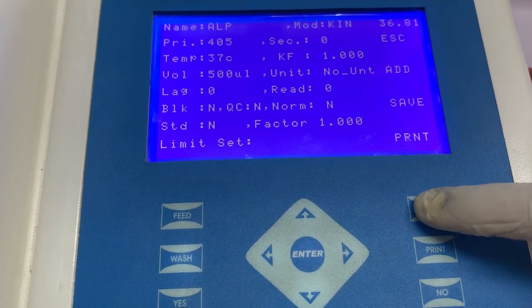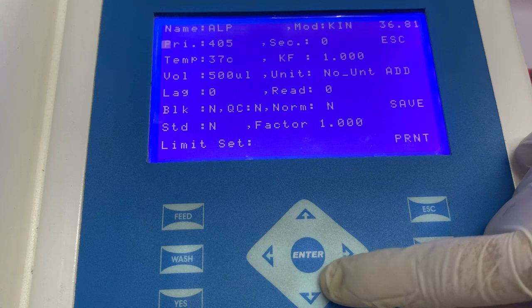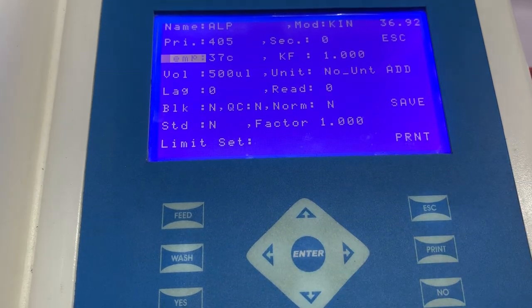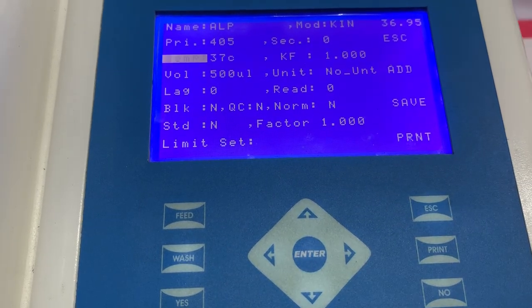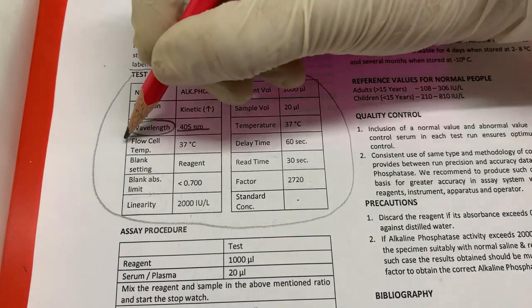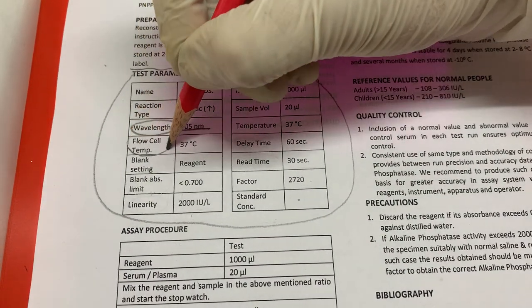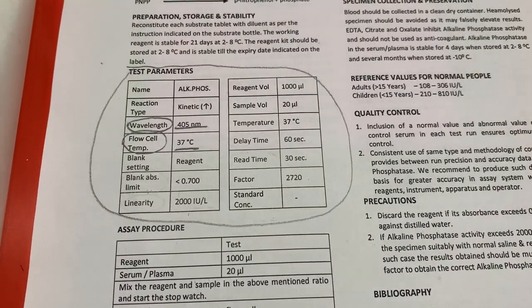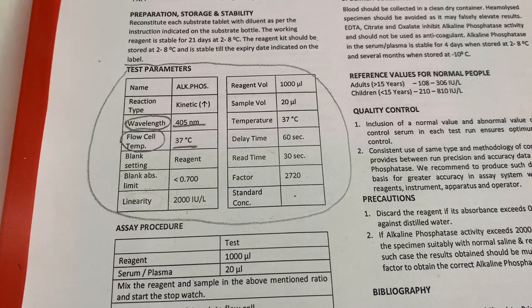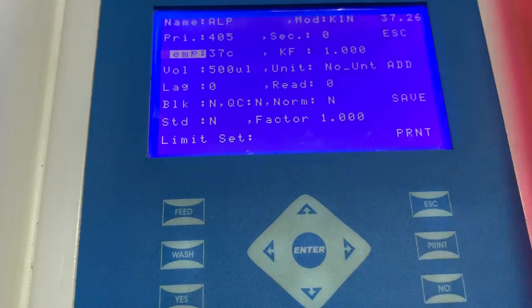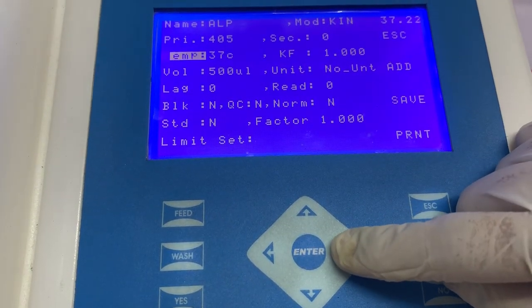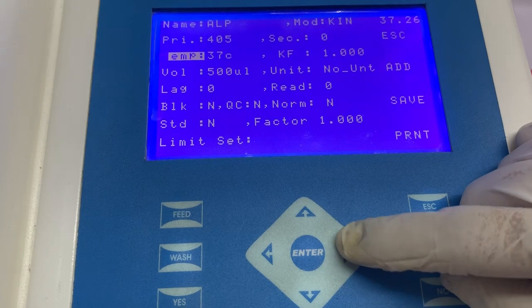Press escape to come back to the home screen. The next information that needs to be added is of temperature or flow cell temperature. Again, this information can be seen in the instructions for use, where the manufacturer clearly mentions at what temperature the absorbance needs to be taken. Because in this case the default temperature mentioned is 37 degrees Celsius, we do not have to change it.